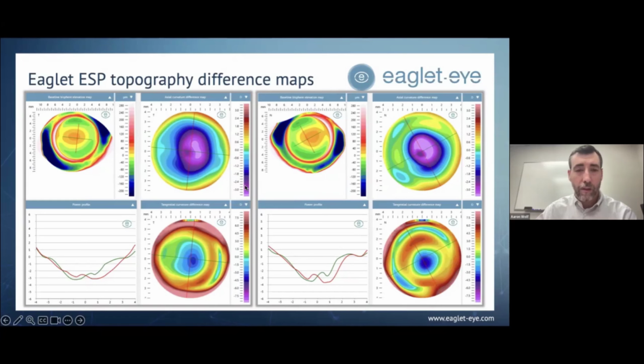And if I look at what this patient was, they were around a -3. Then I look at my scale and I say, okay, where does about 3 happen, which is more of a kind of purple. Well, where does that purple indicate? Okay, now I'm probably at about 2-ish out to maybe 1.5. So I'm getting a good maybe 3.5 to 4 millimeters of my absolute best distance vision, and it'll fade off a little bit from there.